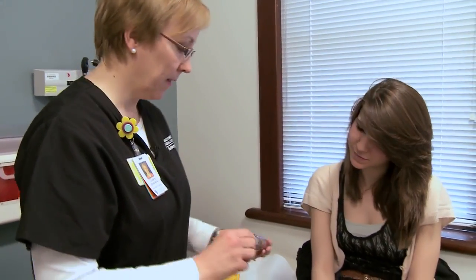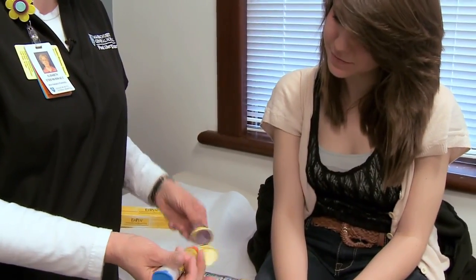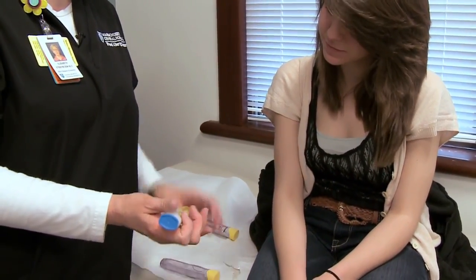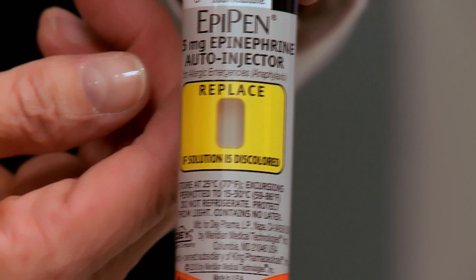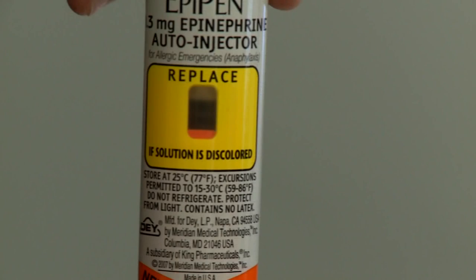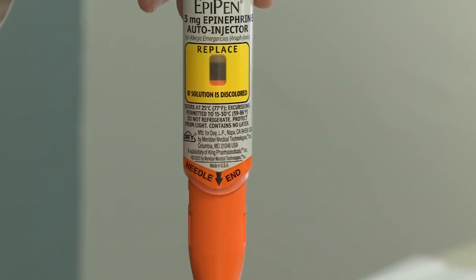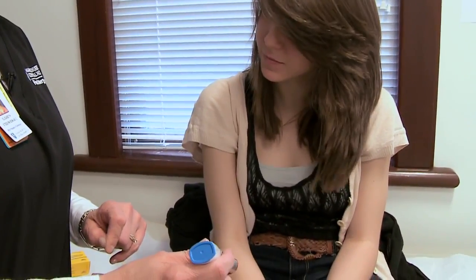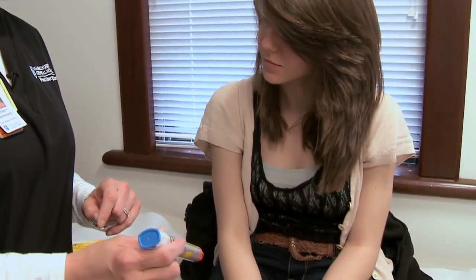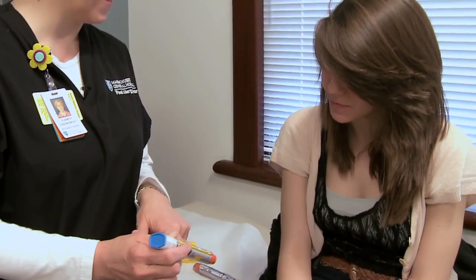This is the real EpiPen. It comes in this hard plastic case and you slide it out like that. It has a window here — that window shows the epinephrine. If there was a red shade down, that would mean it had auto-injected into the case and you wouldn't be able to use it. This medicine is heat sensitive, light sensitive, and cold sensitive, so it really has to come in and out of the house and not be left in a car or outside for prolonged periods.